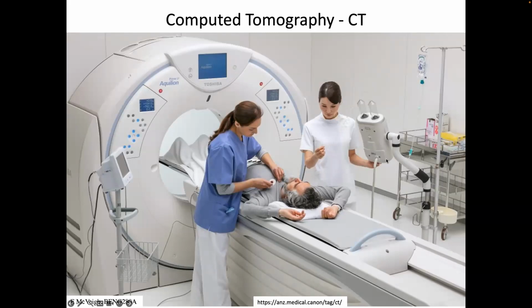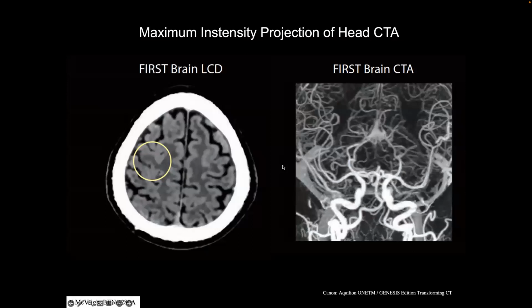This thing is, instead of having a person with a big syringe push contrast into the patient, a robotic version of that. And you just fill it with contrast and it pushes it at a very precise rate. So it'll put, say, 5 cc's per second of contrast through a catheter. And this is local ECG measurements here.